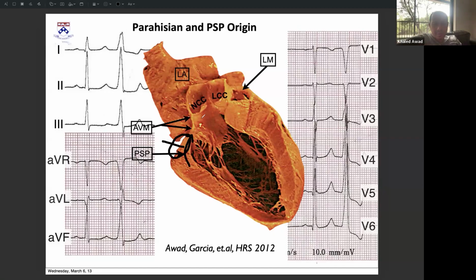We tried from the left ventricle, ablating under the noncoronary cusp and all of that, and there was a lot of conduction system and thick tissue and all sorts of stuff. Then we used cryo and ablated it from the right atrium, which is removed in here, so you don't see it, but the edge of this is essentially on the right atrium. So again, recognize that when you are working with something that is not too far from the His, the patient can end up with heart block. You need to know, and the patient needs to know that.